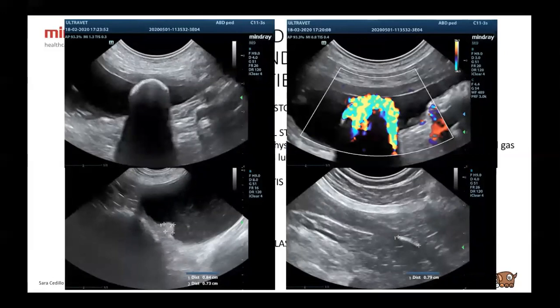Here we have bladder stones — hyperechoic with shadowing — and the twinkling sign with color Doppler. Here is polypoid cystitis with a small polyp in the cranioventral area. And here is a urethral stone — in this case it was not dilating the urethra, so there was no obstruction at the moment.